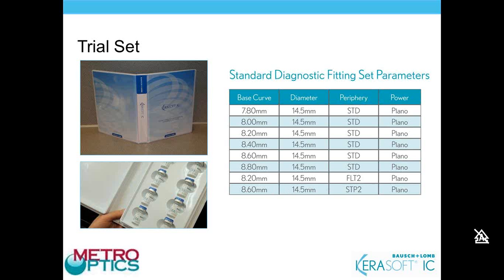So you're kind of mixing and matching your 2 trial lenses into one. I would use that lens in cases of corneal transplants or those oblate corneas from refractive surgery, whether it's RK or post-LASIK or post-PRK. While they do have an inferior ectasia, which is a steepening, the overall corneal profile is oblate. And then there's the 8.2 flat 2 lens in the set. The 8.2 is a relatively steep base curve, and the flat 2 is equivalent to an 8.6 periphery.